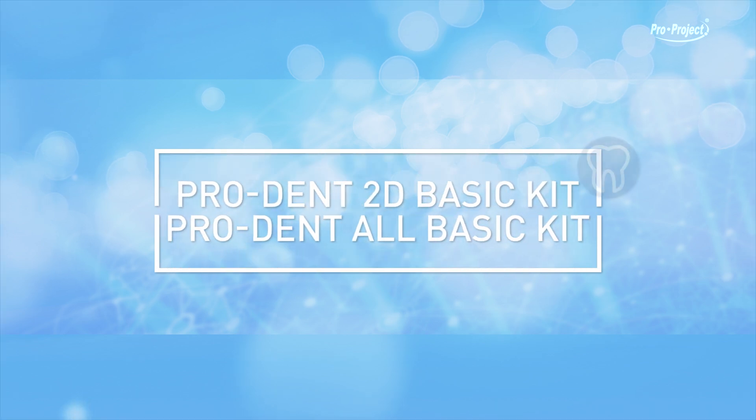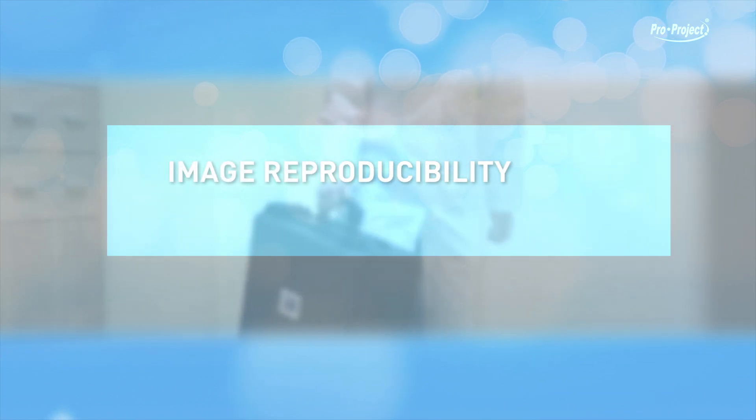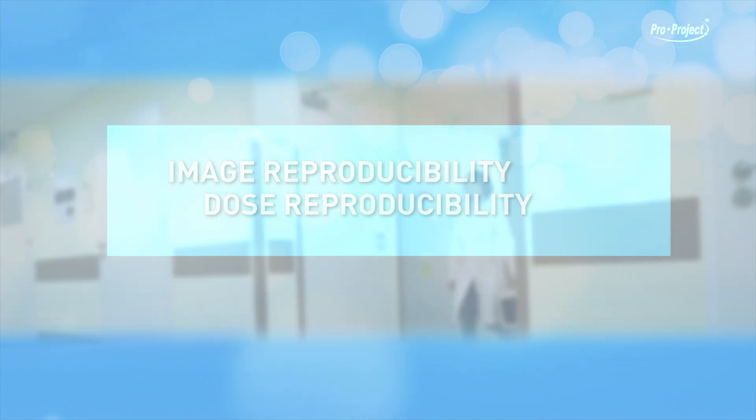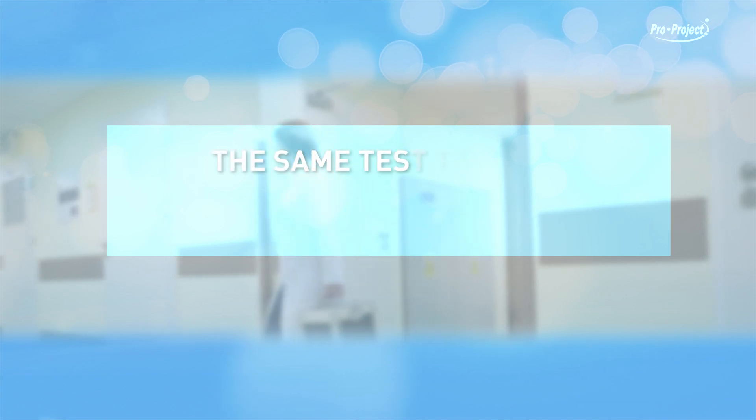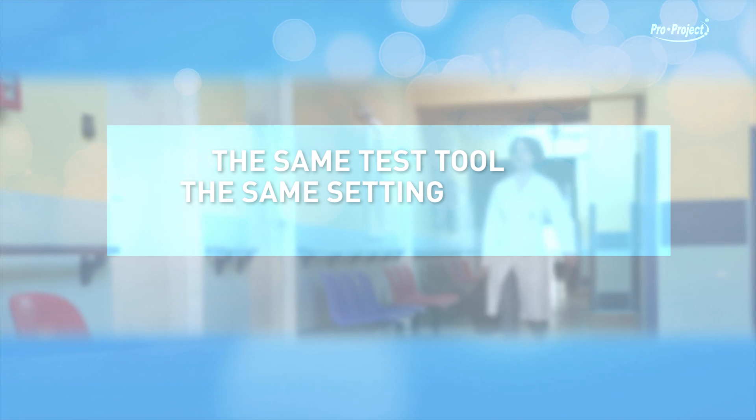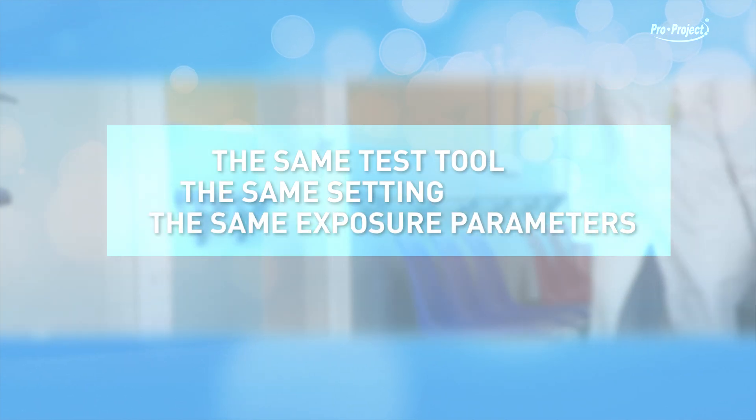Dental radiography ProDent 2D Basic Kit and ProDent All Basic Kit. Consistency checks are performed to evaluate the functioning stability in terms of image reproducibility and dose reproducibility. The check is obtained by using the same test tool phantom at the same setting position in relation to the device being tested and at the same exposure parameters.